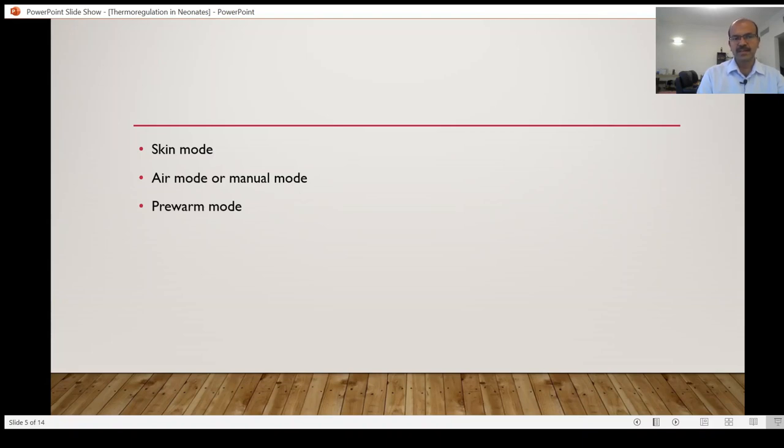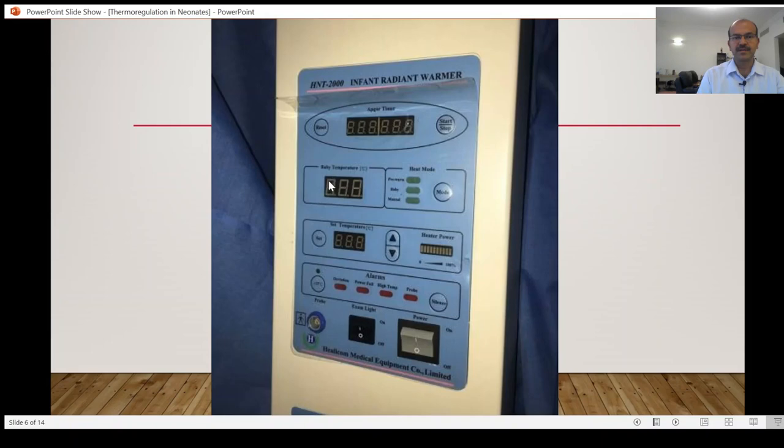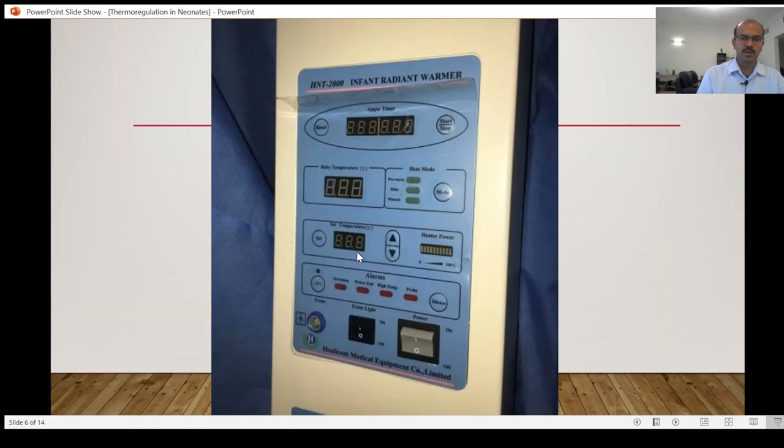So this panel again, you have the ability to monitor the temperature, ability to adjust the mode that you use, and so on.